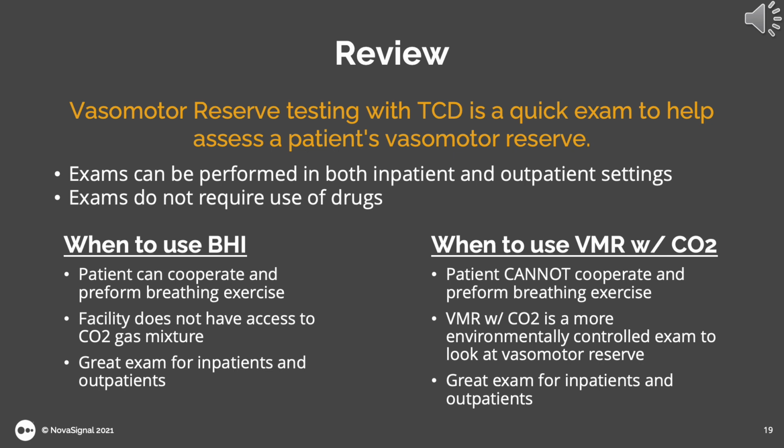Vasomotor reserve testing with TCD is a quick exam to help assess a patient's vasomotor reserve. Exams can be performed on both inpatients and outpatients, and does not require the use of drugs such as Diamox. This is important because drugs like Diamox have a washout period that can last up to 24 hours. This means your patient could have lingering effects from the drug for that period of time. With the TCD vasomotor reserve testing, once the patient's mean flow velocities return to baseline values, we do not expect any lingering effects from the testing past that point in time.